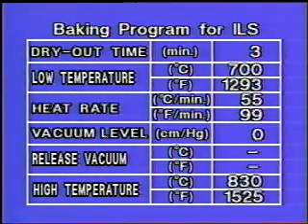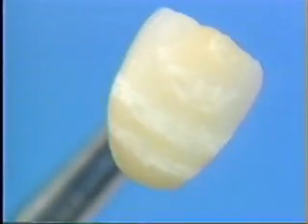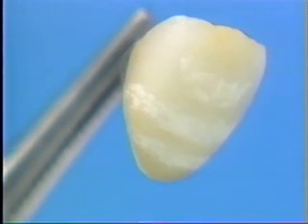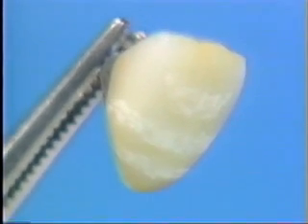Now we move on to the first baking of internal stain. The baking runs from 1293 degrees to 1525 degrees Fahrenheit at room atmosphere. Here is the completion of internal live stain baking, which shows no luster on the stain. This step is mainly intended to settle the stain firmly.